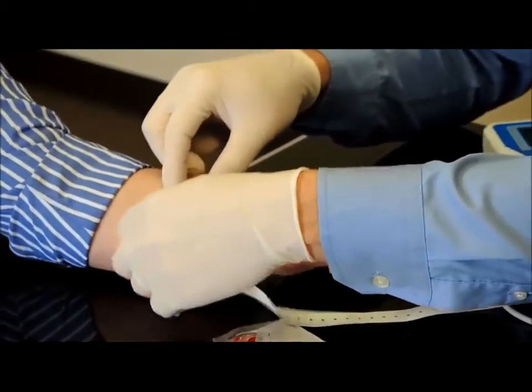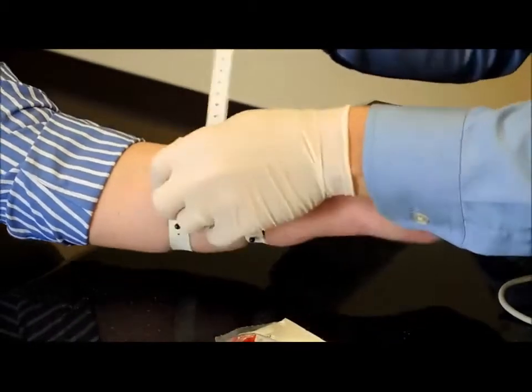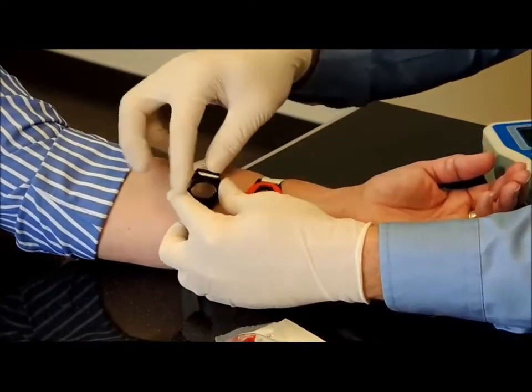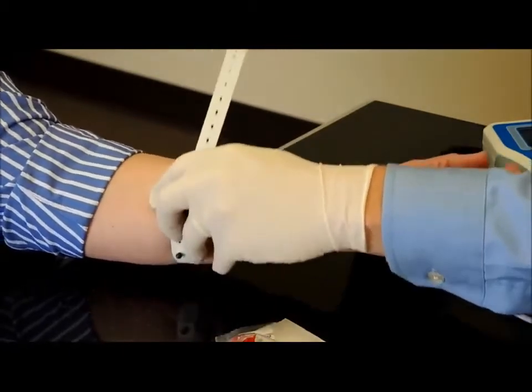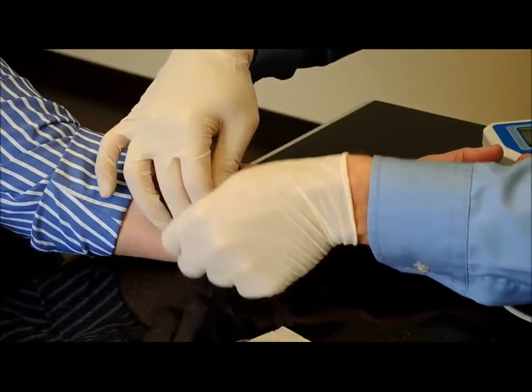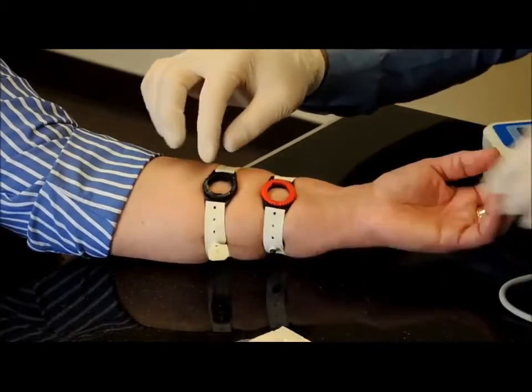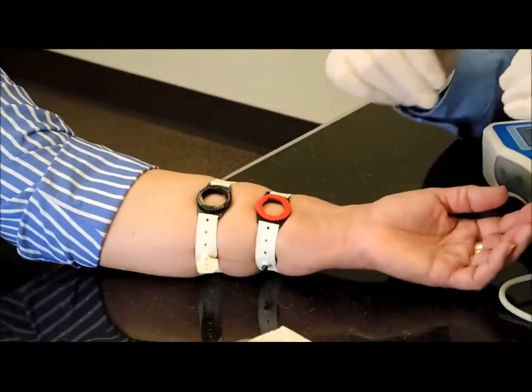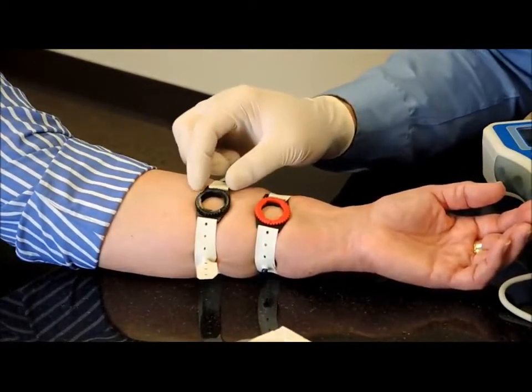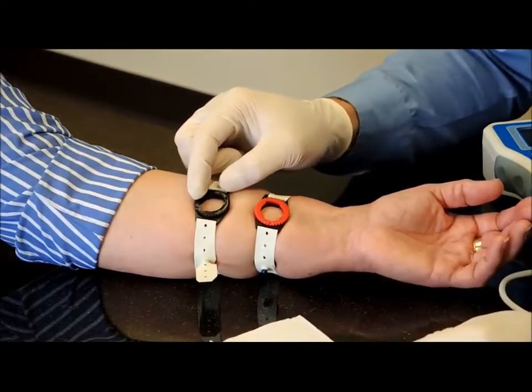And so we put the holder there, run the strap around the arm, go through the holder, and then back around. Make sure it's nice and tight, again with the skin inside of the holder kind of bubbling, doing a little pillow effect. You'll notice when the straps are on the arm, they're keyed.